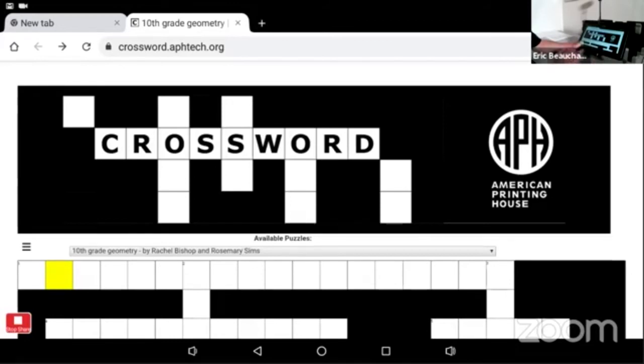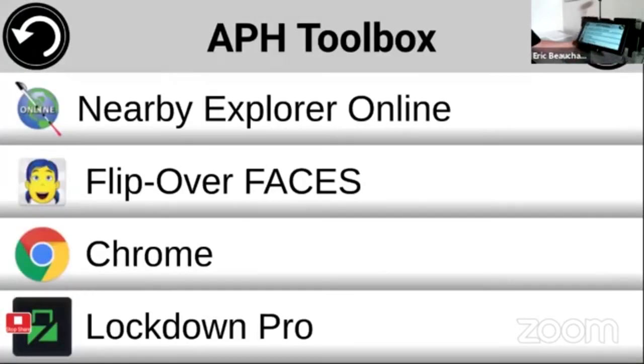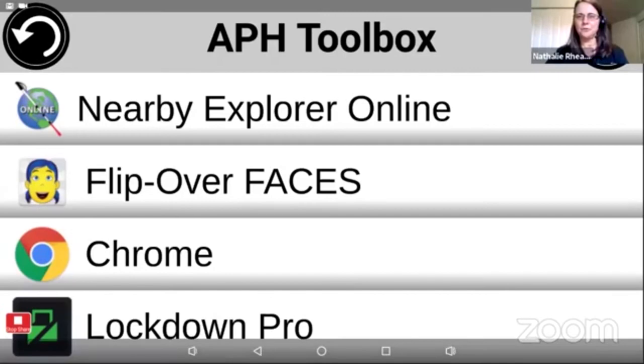And yeah, everything's going to be there except for that part where you have the quick access and the all apps. So the difference is here for the Matt Connect and the Prodigy Connect 12. So we're good. No more questions.